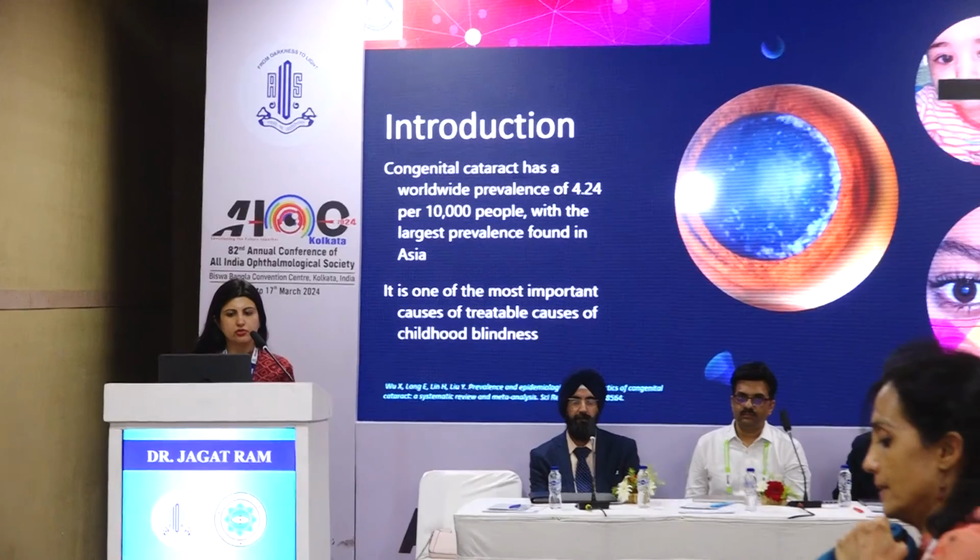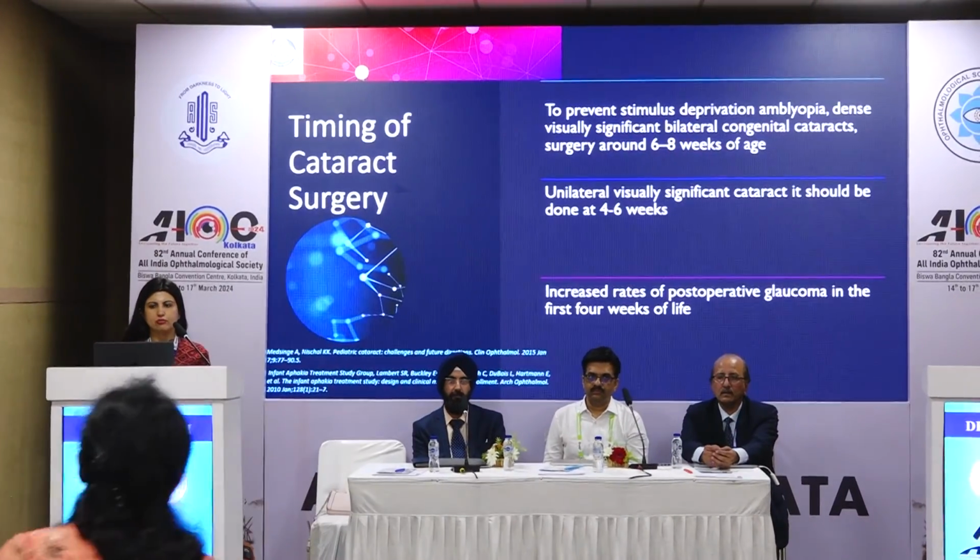Thank you, sir. Good afternoon to everyone. Today I'll be presenting the surgical management of pediatric cataract, a video-based learning course, along with my co-instructors and chief instructor, Professor Jagat Ram. So the basic steps of pediatric cataract surgery for a novice pediatric surgeon. Congenital cataract has a worldwide prevalence of 4.24 per 10,000 people, with the largest prevalence in Asia. It is one of the most important treatable causes of childhood blindness.